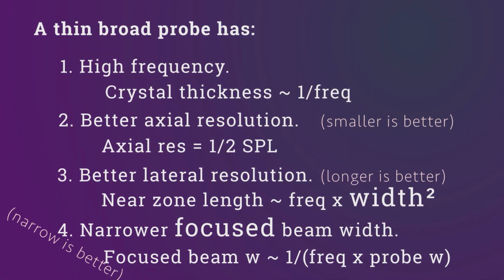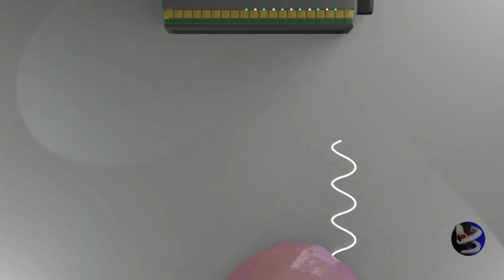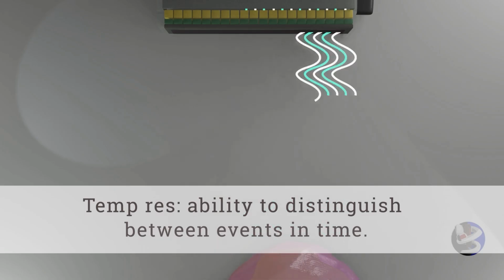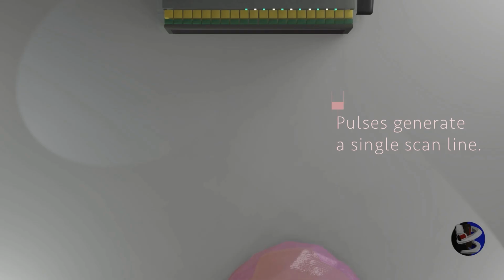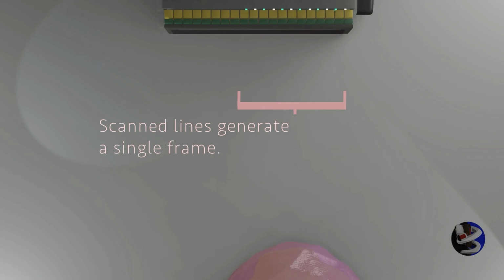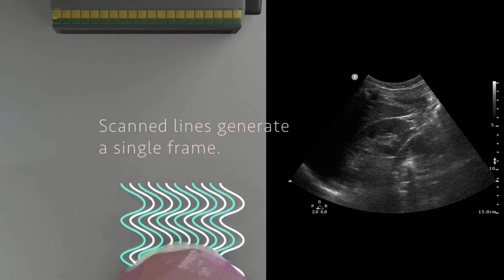Temporal resolution. Temporal resolution is the ability of the ultrasound system to distinguish between events of rapidly moving structures that are separated in time. When we're using the brightness or B mode in ultrasound, all the piezoelectric elements are simultaneously scanning a plane by emitting repeated pulses. These pulses create their corresponding scan line, and once they return to the probe, they are then represented in the ultrasound display as a single frame.